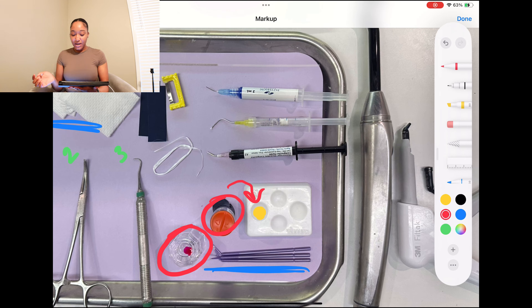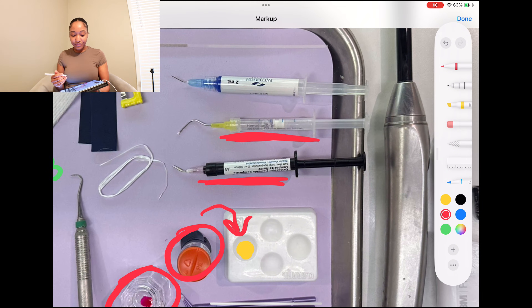Moving on, this is my flowable. Flowable can be used for the whole composite procedure if your doctor is not a big fan of packable. A lot of the newer dentists are not the biggest fans of packable, even though I think packable offers more structure and support to the tooth — just my personal opinion. Next, I have my hemaban gel. Hemaban gel is usually used to make blood clots and stop blood from coming around, especially if your dentist nicks the gums or there's just blood present. You place this on the tooth and it's going to stop it.